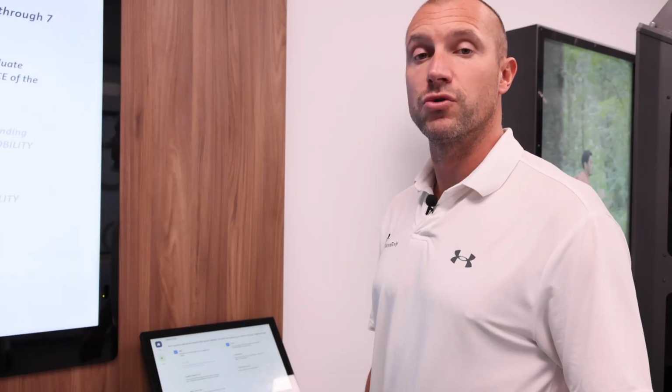We are now going through the 2 minutes step test. The 2 minutes step test has been designed to investigate the cardio and the circulatory system of the patient through a repetition, a sequence of stepping on site. According to the number of repetitions of the patients, the software will display a final score through normative data in terms of normal, above the average or under the average.